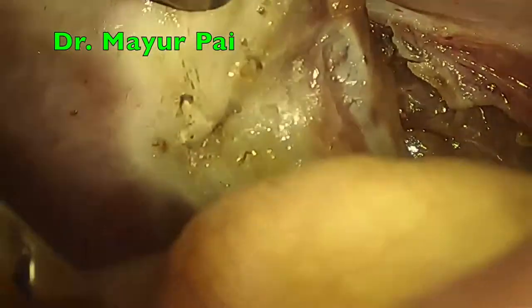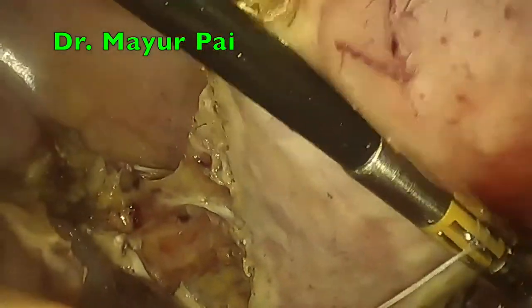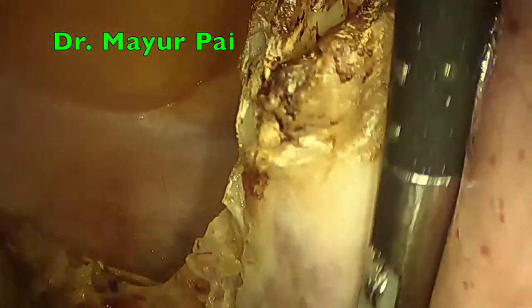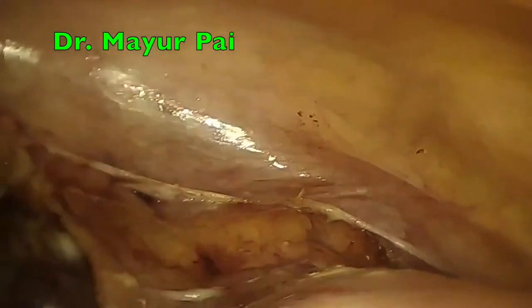The entire idea of performing a hysterectomy, may it be laparoscopic, vaginal or abdominal, is to get rid of all the connections of the uterus, all the connective ligaments of the uterus that hold it in place. While doing that, we also have to block and cut the uterine blood supply and the venous drainage. While doing this entire step, we have to be careful not to damage the bladder in front or the rectum or the bowel at the back.